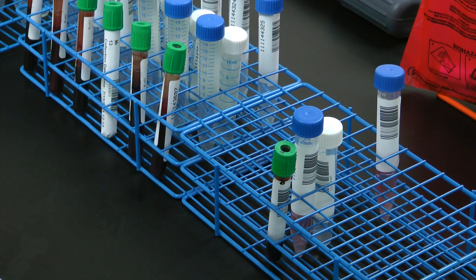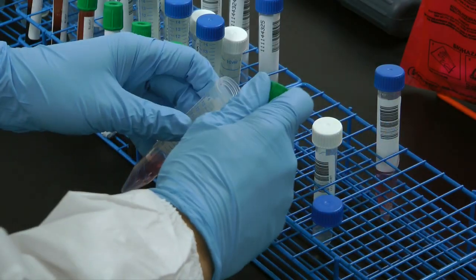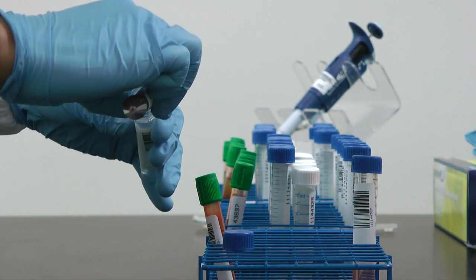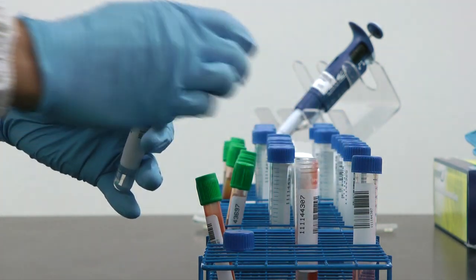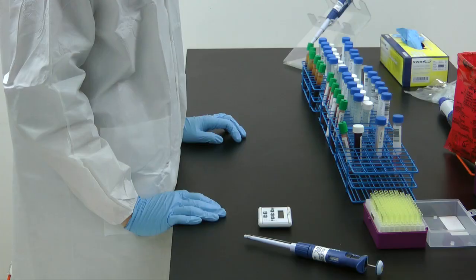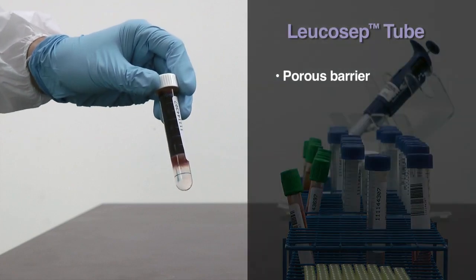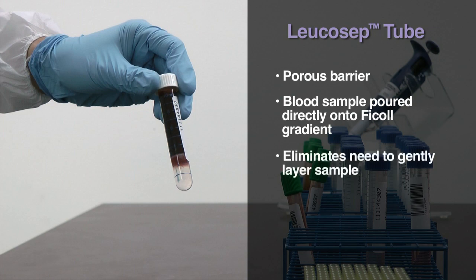The technologist then proceeds with isolation of peripheral blood mononuclear cells or PBMCs. Treated whole blood is mixed with RPMI 1640 medium and then poured directly into a Leukacept tube. Leukacept tubes offer a time-saving approach to FICOL gradients. The tubes contain a porous barrier that enables the blood sample to be poured directly onto the FICOL gradient, eliminating the need to gently layer the sample.